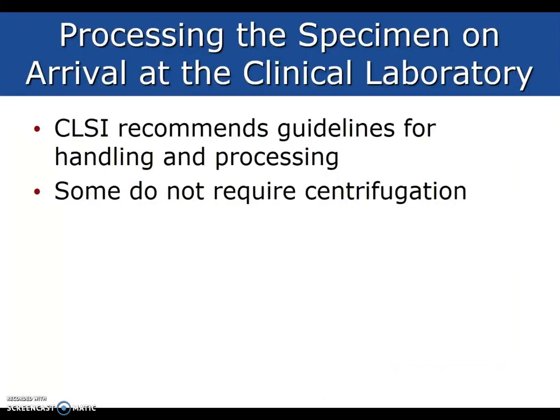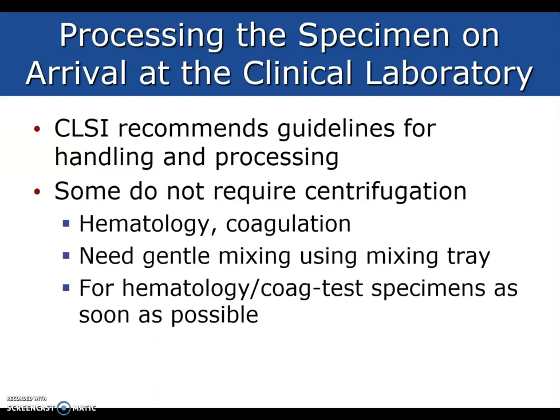CLSI recommends guidelines for handling and processing. Some specimens do not require centrifugation. Some hematology and coagulation tests require whole blood and need gentle mixing using a mixing tray. For hematology and coagulation test specimens, we're going to test them as soon as possible.